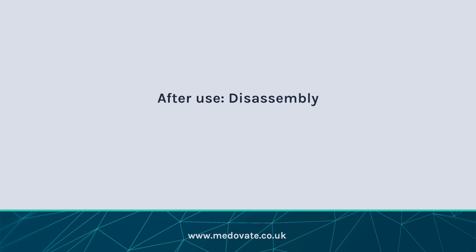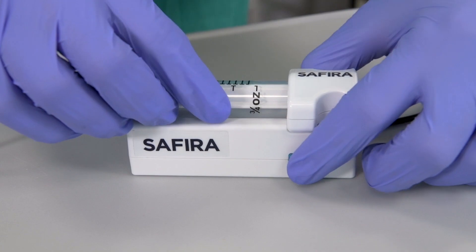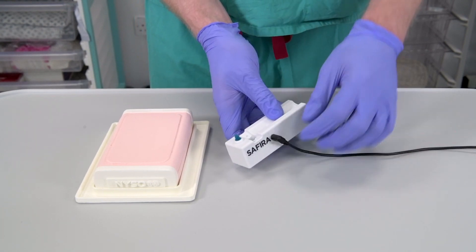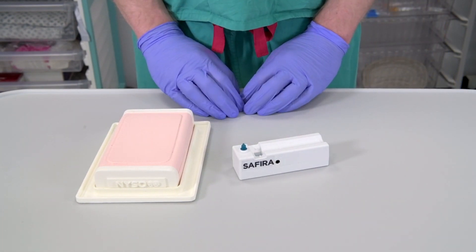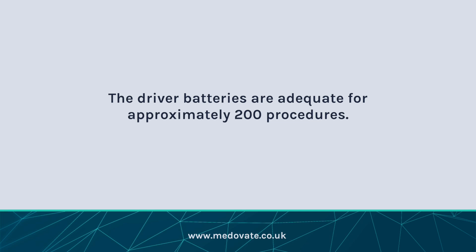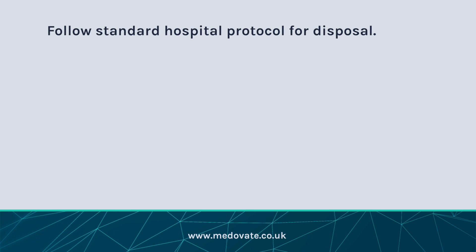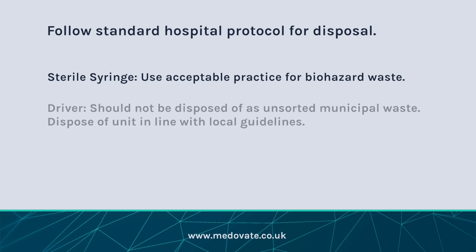Disassembly after use. After completion of the procedure, remove the syringe from the driver by pressing the coloured syringe release button on the side of the driver. Disconnect the foot pedal. The driver and foot pedal components should be cleaned and stored according to hospital standard practice for reuse. The driver batteries are adequate for approximately 200 procedures. Follow standard local hospital protocol for disposal. The sterile syringe should use acceptable practice for biohazard waste. The driver should not be disposed of as unsorted municipal waste; dispose of the unit in line with local guidelines.